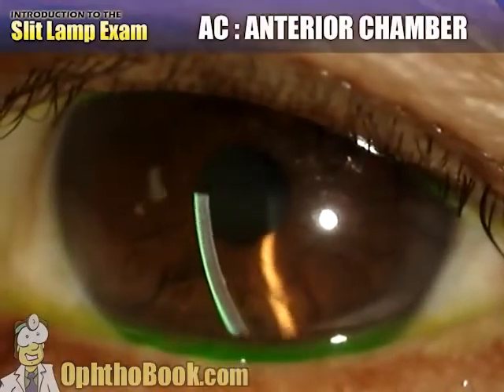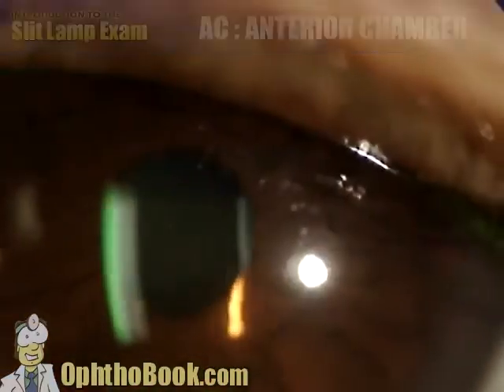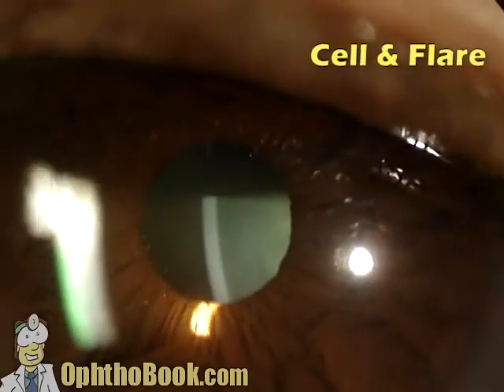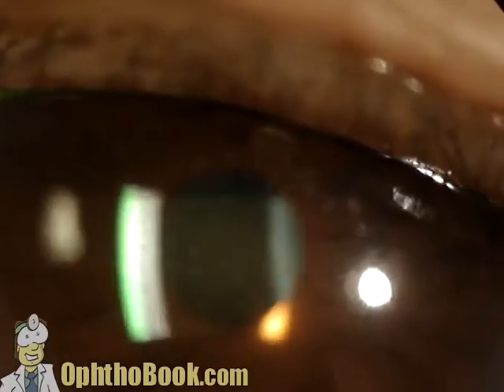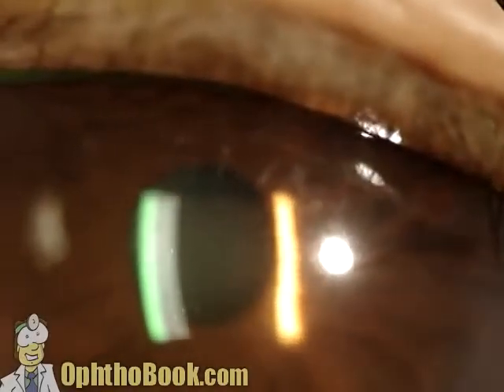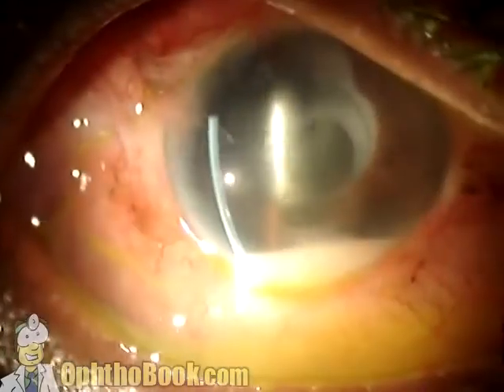This is the anterior chamber, and when looking at the anterior chamber, make your light beam shorter, a little bit thicker, and turn the intensity as bright as you can. And you'll see cell and flare. Cell are individual cells floating in that potential space there, and flare is that sort of foggy appearance. It's from protein released from inflamed blood vessels. The brighter the light, the easier it's going to be seen. And if you use the pupil as a background, it makes it a lot easier. This is more flare, less cell, but you get the idea.